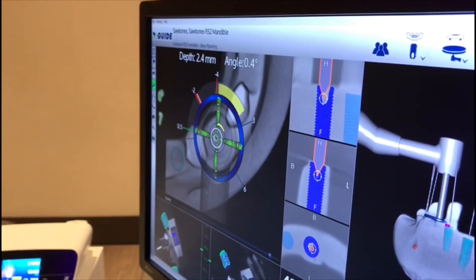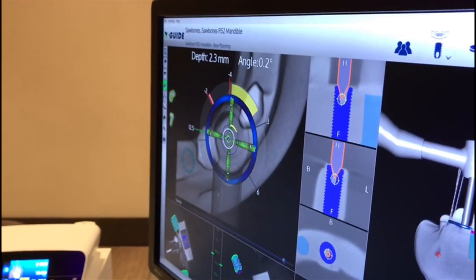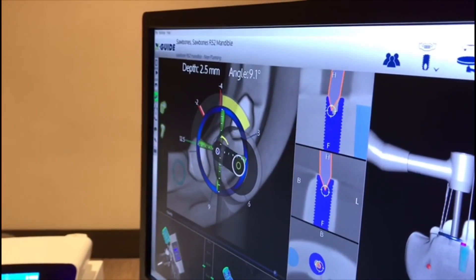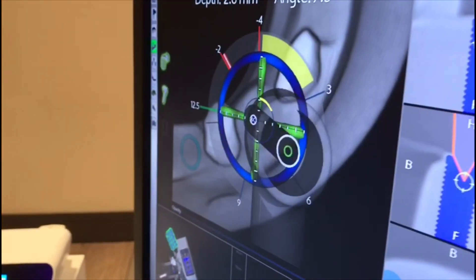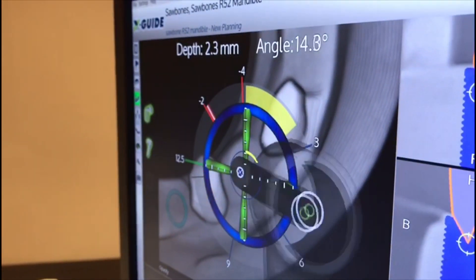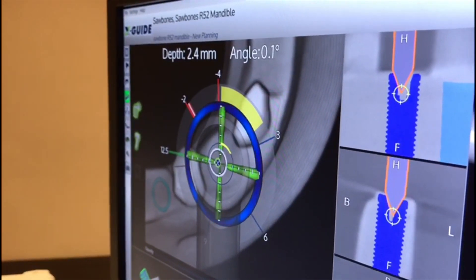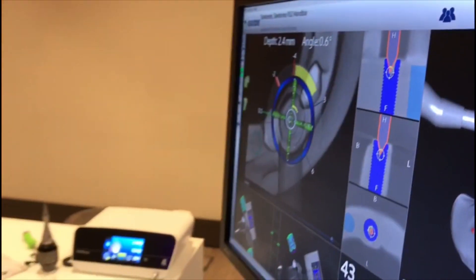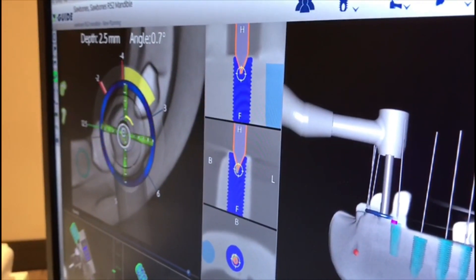The navigation — we're looking at circles right in the middle. This is what we call the X point. I want the tip of my drill, which is this blue circle, to be in the middle of my green X — that's the center of the implant that I planned ahead of time. The back of my drill is this green circle moving around, and as I move it around, the angular deviation at the top of the screen changes. As I line them up, that angular deviation becomes very small. Once we get in alignment, the possibility of error is about 220 microns. The blue area on the screen is the channel — exactly where you plan to place your implant.